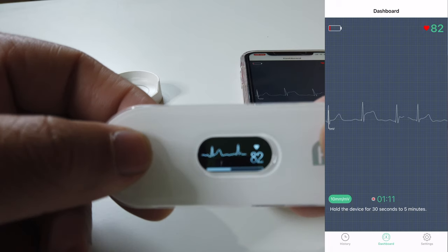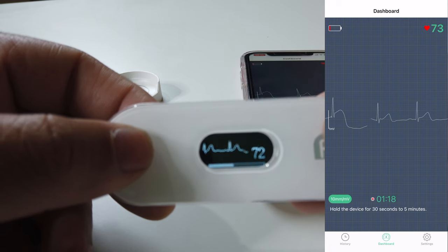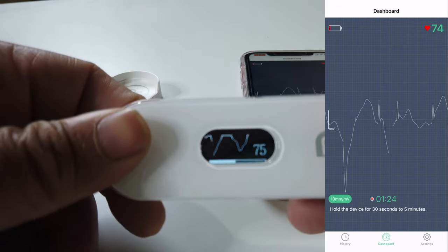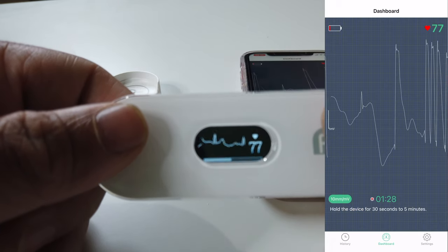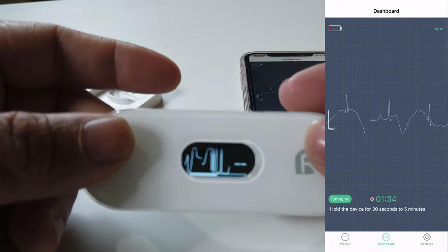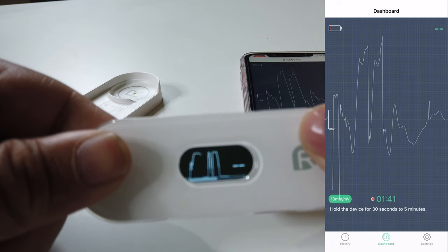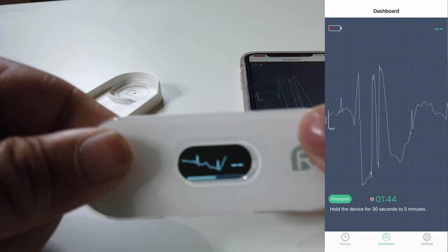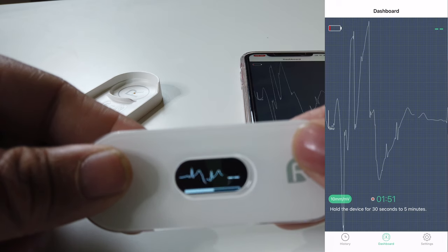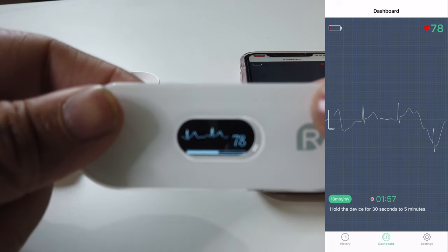Now you might be wondering if this is actually accurate. We're gonna do a little test — we're gonna switch through my fingers and see if it reads irregular. It should read irregular because I'm moving a lot, it's not gonna have a consistent reading. As you can see, as soon as I move my fingers it fluctuates a lot and the heartbeat sensor right there is not even reading it. So as you can see, it is actually reading your EKG accurately, because as soon as you change your finger alignment and start to move, it'll screw up the readings.